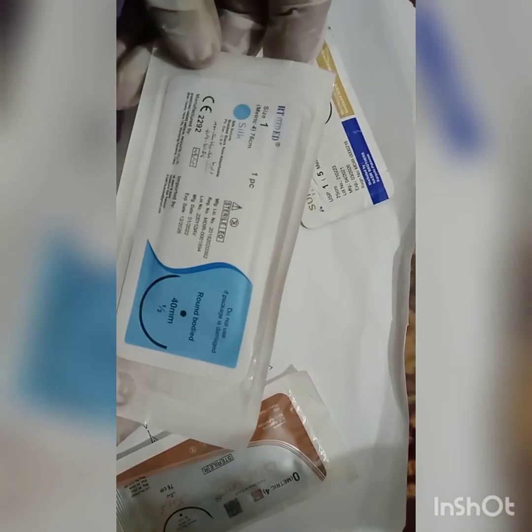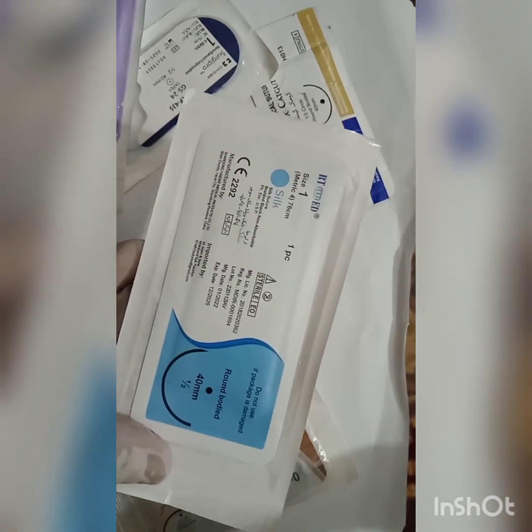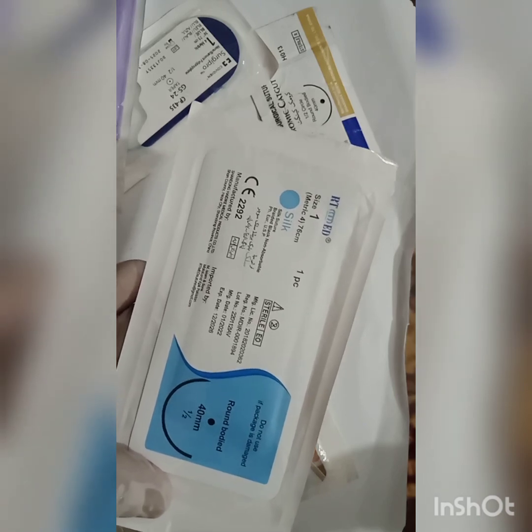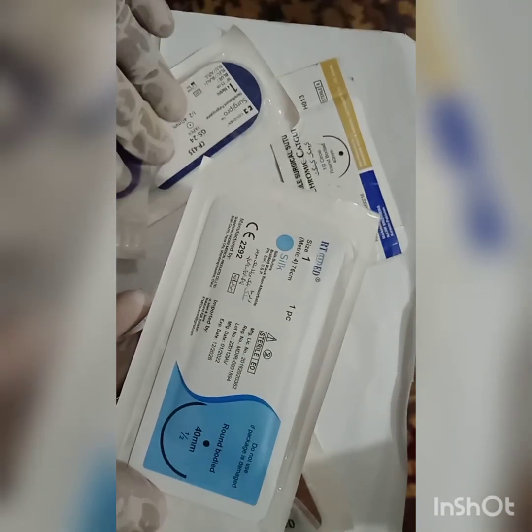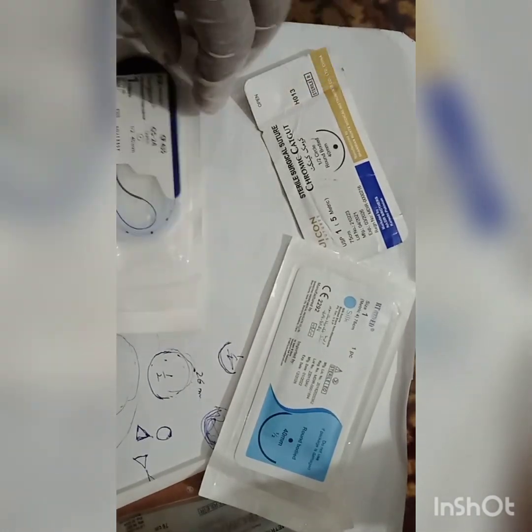Silk is less likely used today. Initially it was used for the skin closure and ligation of the vessels because of its stable knot. And other sutures, the polydioxanone, which is not available here, may be used for the CBD surgeries on the hepatobiliary system.